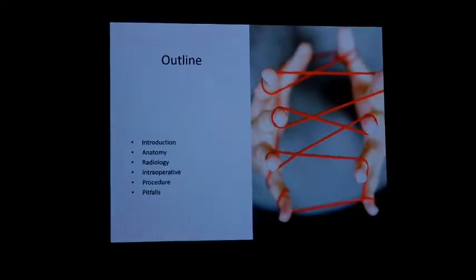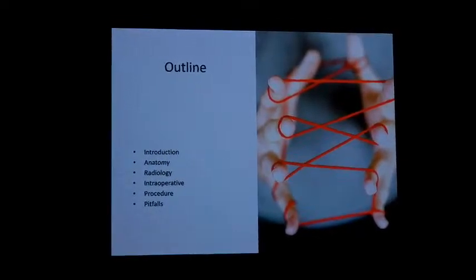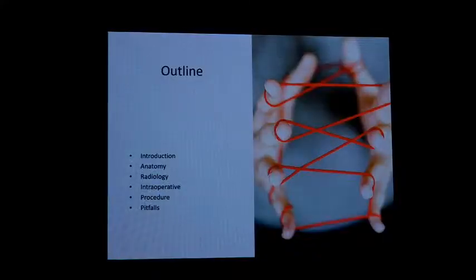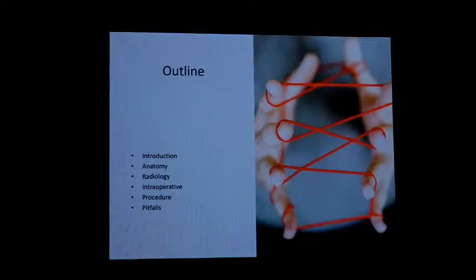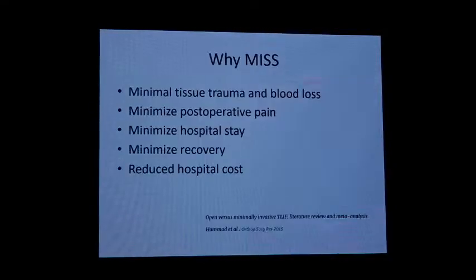The outline of the talk is going to be on the introduction, why we need to do MIS TLIF, what the relevant anatomy is, what radiology we need to study, what the intraoperative landmarks are, what the procedures are, and what the common pitfalls are.